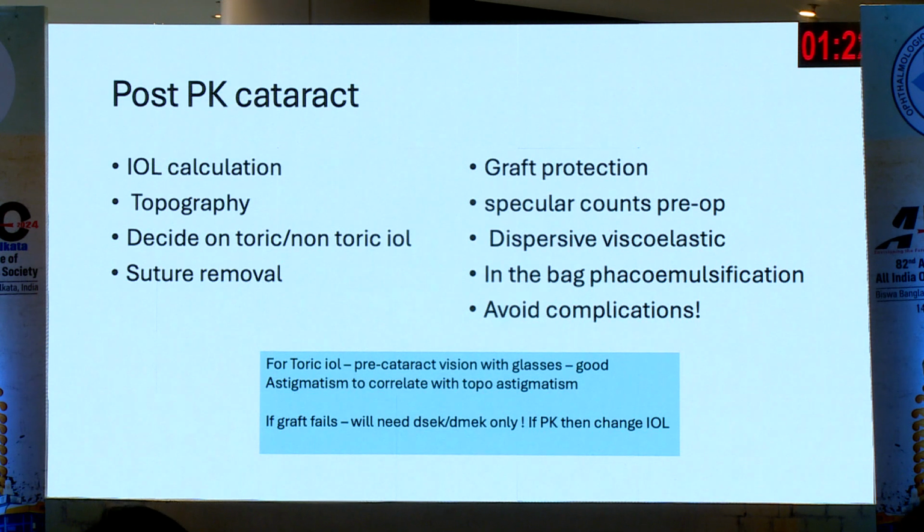You would take all measures to protect the graft, which would be a dispersive viscoelastic, obviously an in the bag phacoemulsification, and you would want to avoid a PCR at all costs.